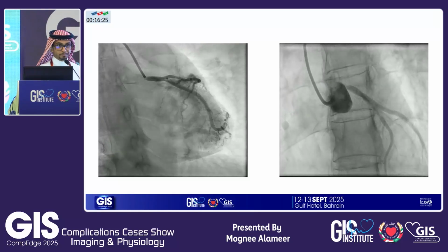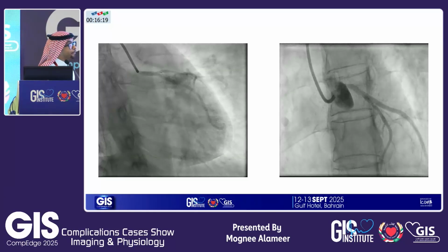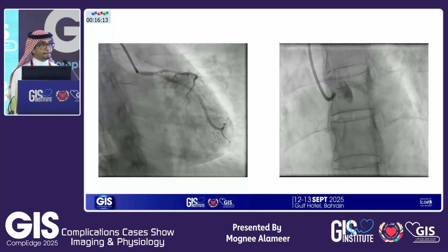Okay, so you'd like to ask the audience what they would do next, right? Sorry? You're asking the audience what they want to do next? Yeah, so. Right, Doctor, what would you like to do? Anybody there who doesn't want to image this?